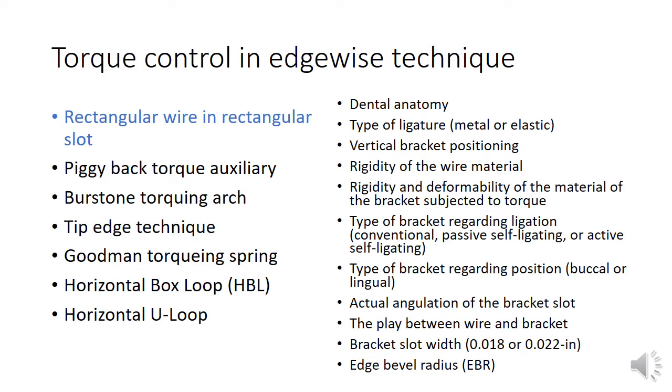I have listed 11 points that need more attention when we are using rectangular wire in the bracket slot. Let's review them one by one.